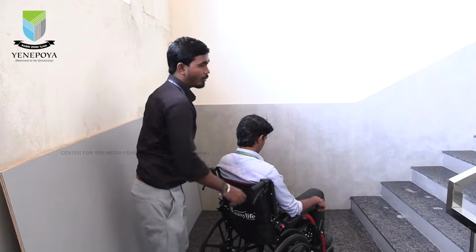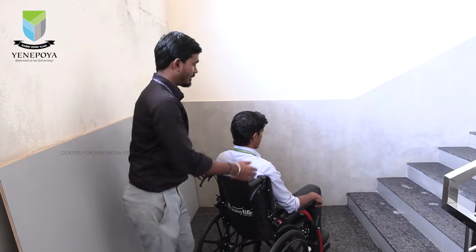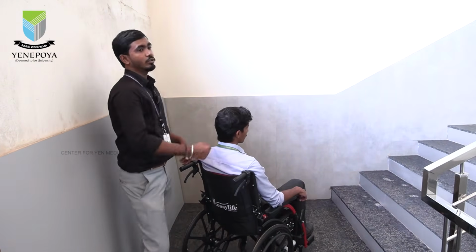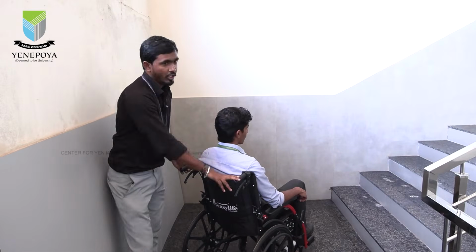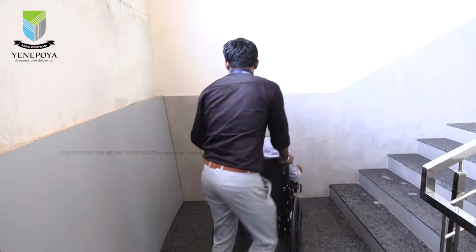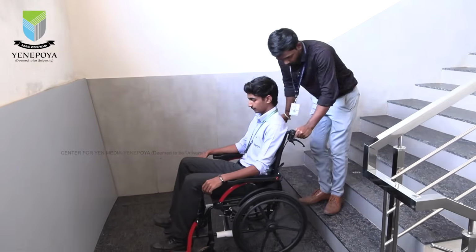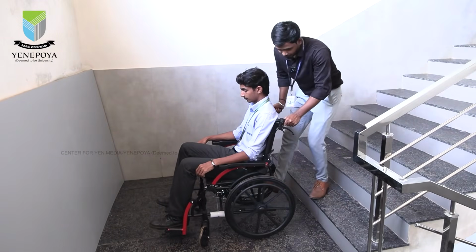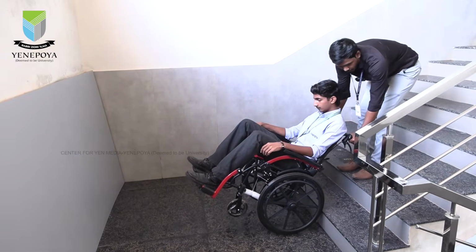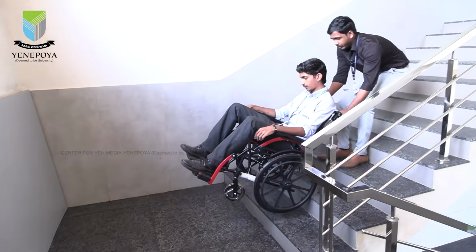Now we are going to see how we can transfer by one person, climbing upstairs and downstairs. Imagine this person is a spinal cord injury patient, so that person cannot climb upstairs and downstairs with a wheelchair. So definitely he needs help. What we have to do is first turn this person towards the edge of this one. Then I will press the anti-tip bar so that it goes to a wheelie. Then come to the edge, then I will push the person up. Again the same thing.